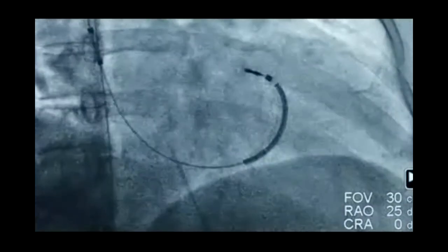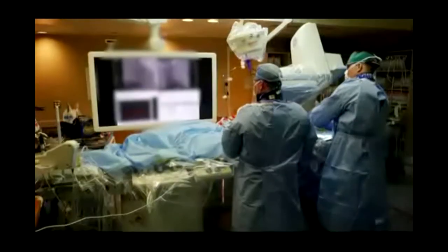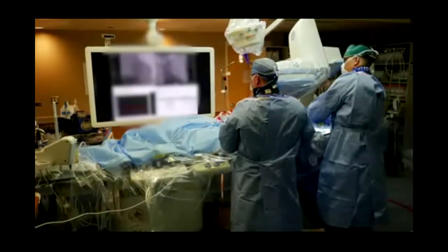Finally, it jumps forward right there. And now we can lower that lead into the body of the right ventricle and advance that lead to the apical position. We want that lead to sit as apically as possible along the floor of the right ventricle so that it encompasses most of the ventricular myocardium within the shock trajectory should defibrillator therapy ever be necessary.